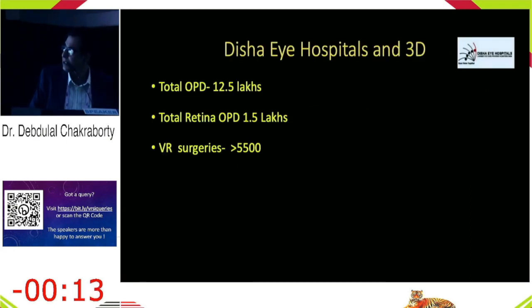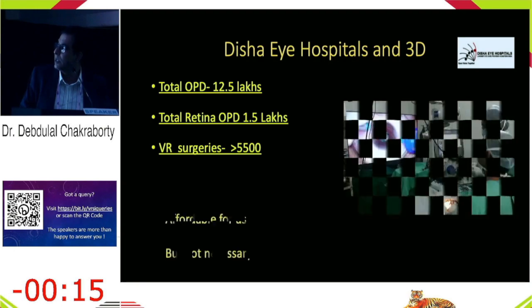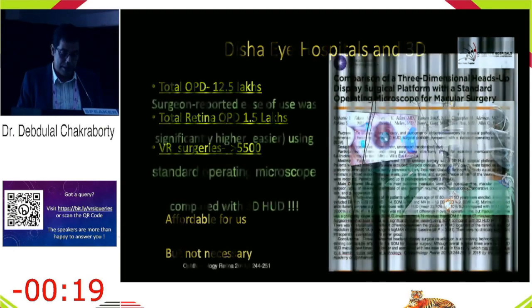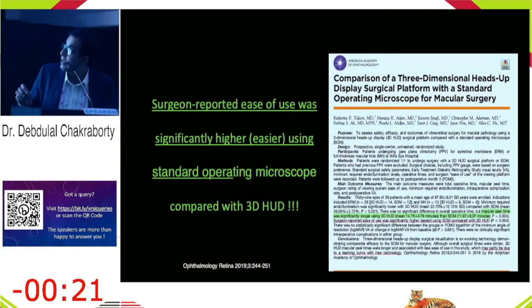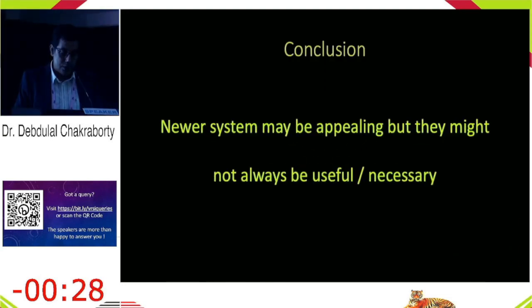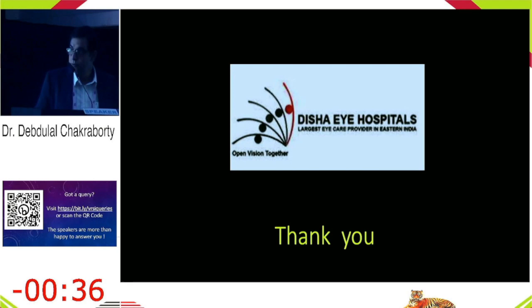However, with more than 5,500 surgeries, I am at a place where we can afford it, but we thought we could utilize this money for something better. Surgeon reported ease of use was significantly higher using the standard operating microscope. So I think that answers everything. Any new technology that comes in, really think about it, do a reality check, and then maybe you can purchase it. Thank you so much.